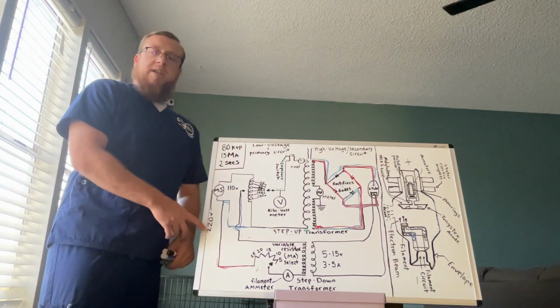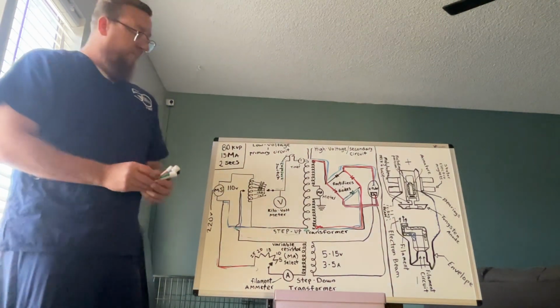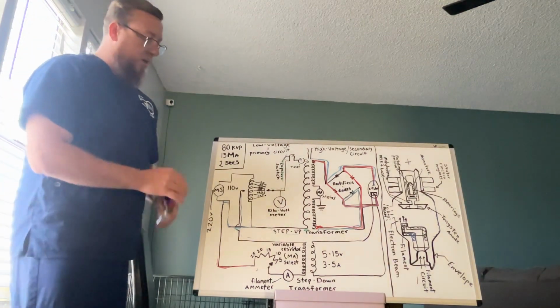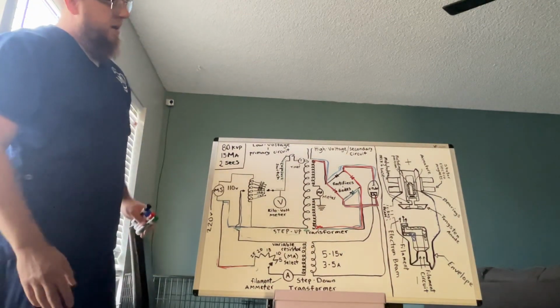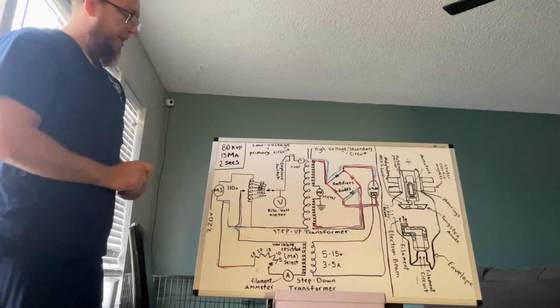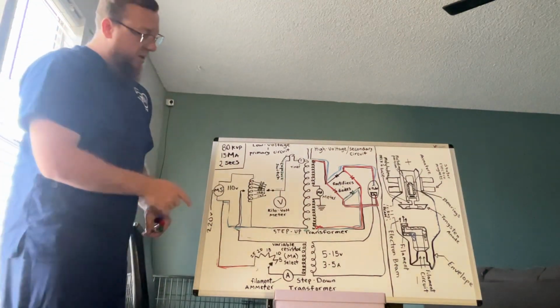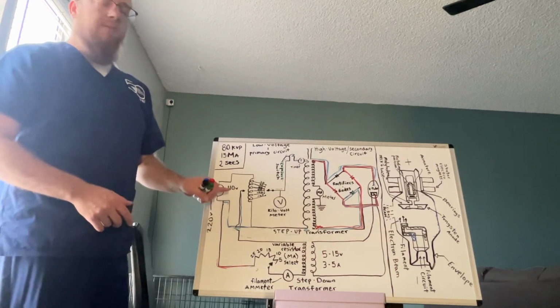letting you know that there's going to be 220 volts that are going to enter a building from a transformer that's on the outside. And once it enters a building at 220 volts, once we hit this main switch on the X-ray circuit, those 220 volts will be converted to 110 volts. And 110 volts will be flowing through this entire circuit up to a certain point, and the current that's coming in through the building into the X-ray circuit will be alternating current. So once we hit this main switch, it's going to convert the 220 volts into 110 volts.